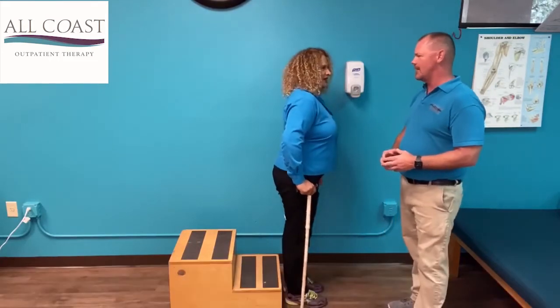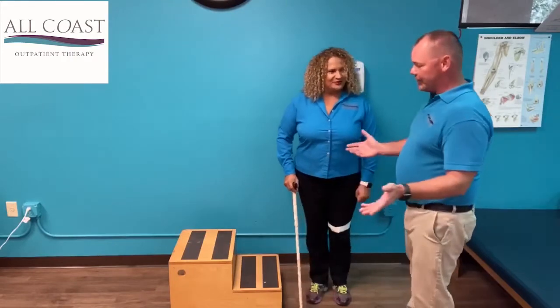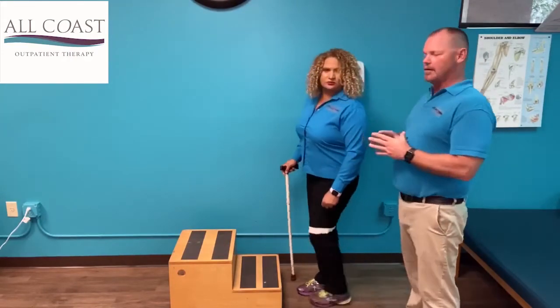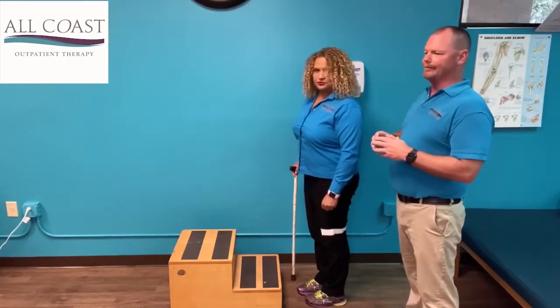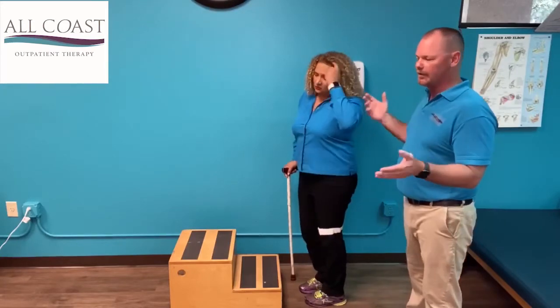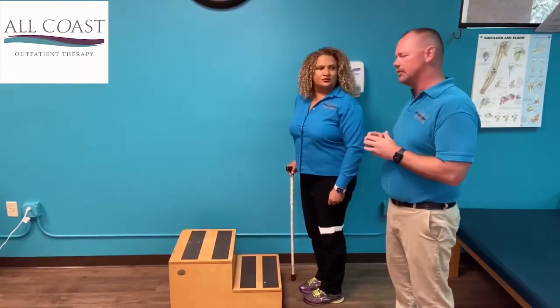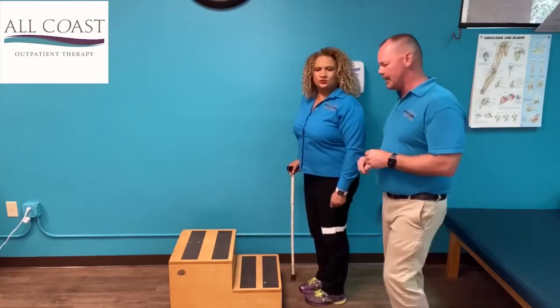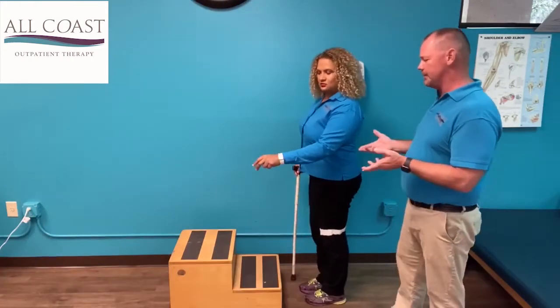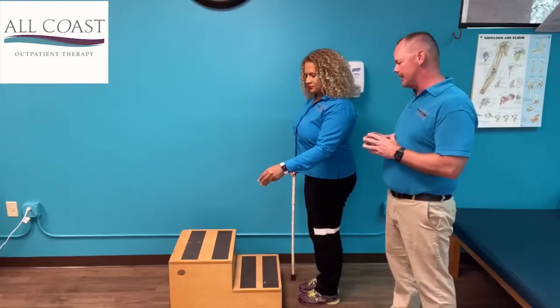Perfect — you did a good job. So that's steps without a handrail. If you come up on any steps, most of them have one rail. Some have two rails, but you always don't get to pick which one you get to use. Let's say we have steps that have only a left side rail. It's going to be pretty much the same, but you always want to hold the rail when you're going up and having any issues.